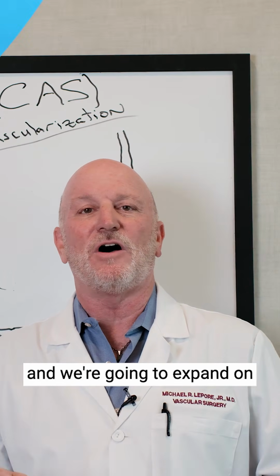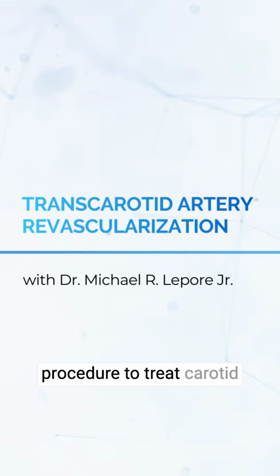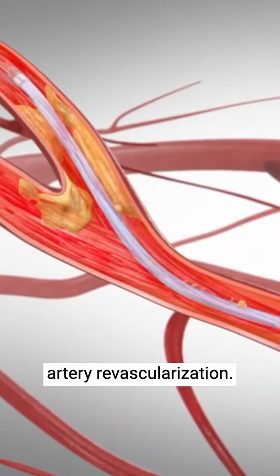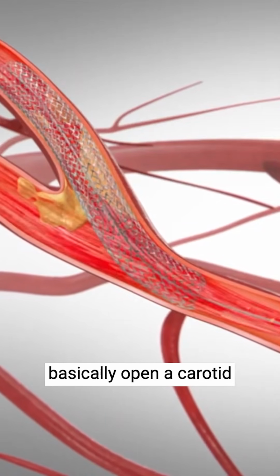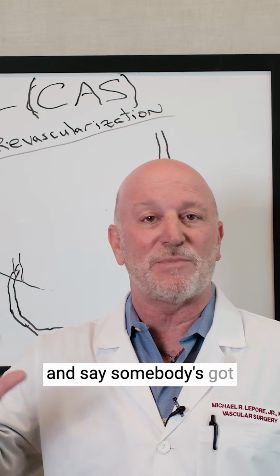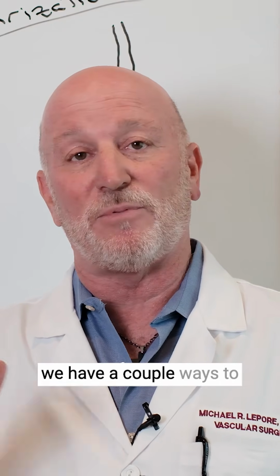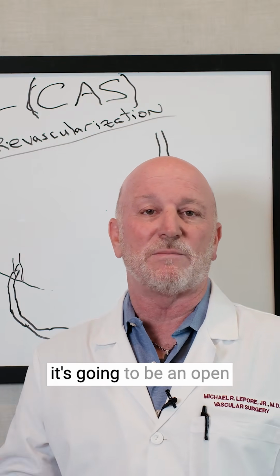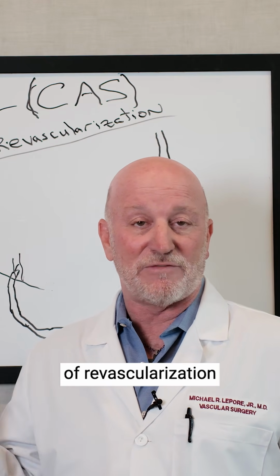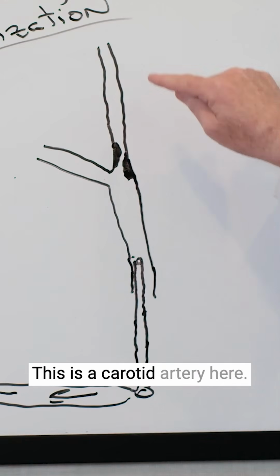And we're going to expand on carotid artery disease, and I'm going to talk about a specific procedure to treat carotid artery disease. Transcarotid Artery Revascularization and stent. Well, it's a way to basically open a carotid artery, which I've spoken before about the reason. So let's just skip that part and say somebody's got a greater than 80% carotid artery blockage in an asymptomatic patient. We have a couple ways to decide to treat them, whether it's going to be an open carotid endarterectomy or transcarotid artery revascularization, or TCAR, which we're going to stick to for now so I don't have to keep saying that. This is a carotid artery here.